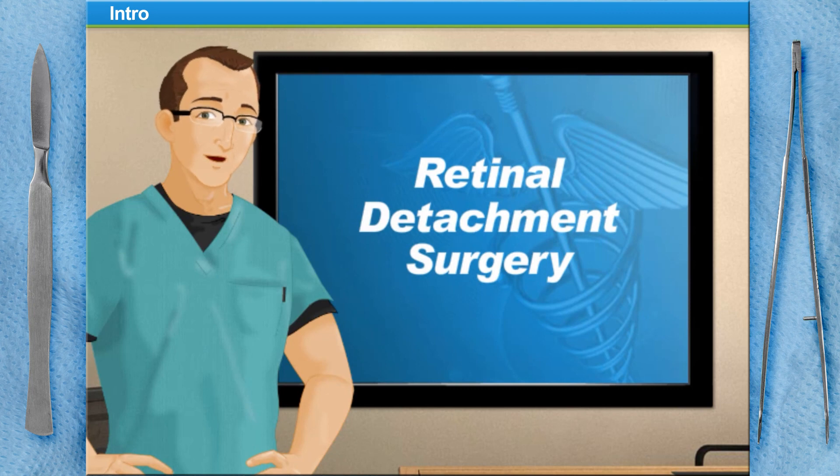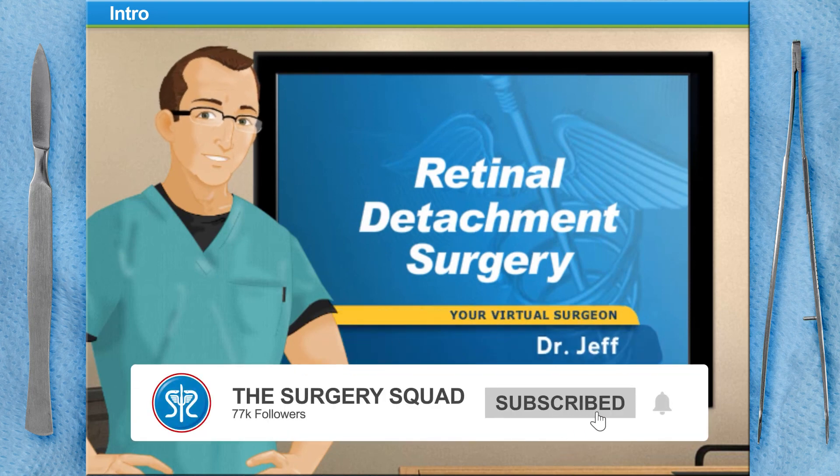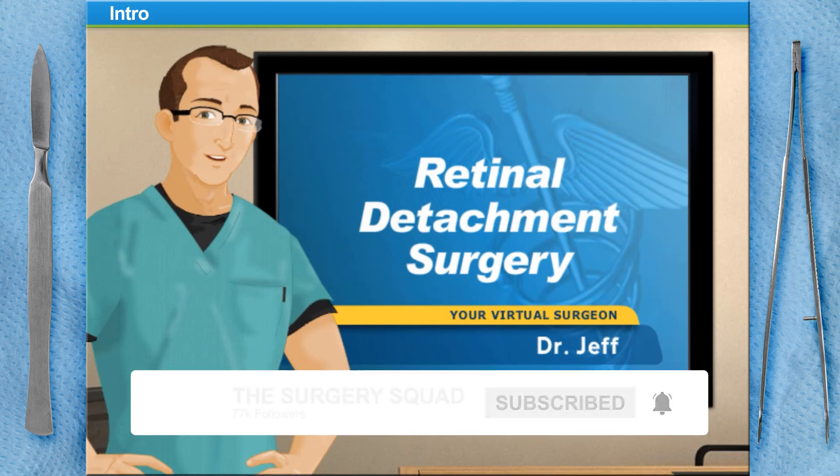Hello and welcome to Surgery Squad's Retinal Detachment Surgery. I'm Dr. Jeff and I'll be guiding you through this procedure today.